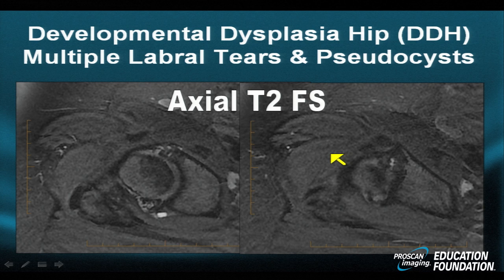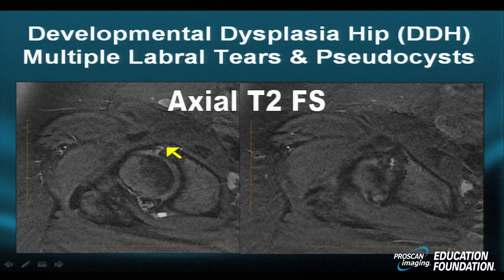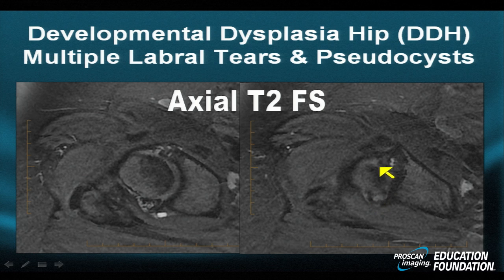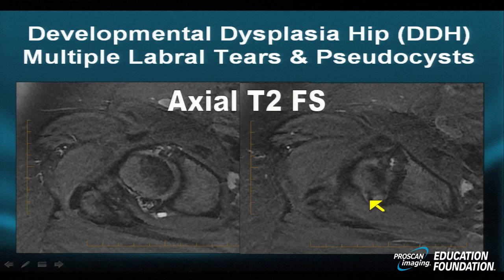Here is a patient with DDH — developmental dysplasia of the hip. There is a large labral tear seen anteriorly in an axial fat-suppressed sequence with multiple small cysts in front of it. There is also a macerated posterior labrum with a larger cyst associated with it. Going slightly higher, we see the tear extends all the way from front to back with multiple small cysts — typically what you see with repetitive trauma and cam, but especially with pincer impingement, progressively over time.